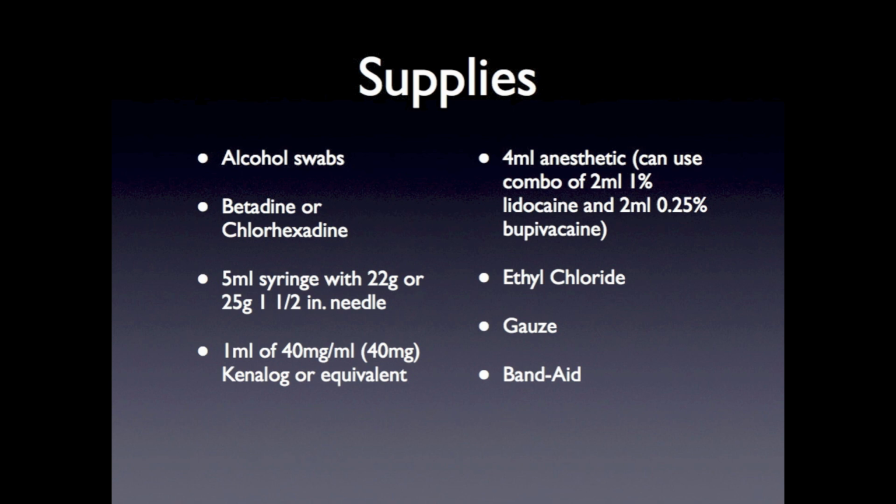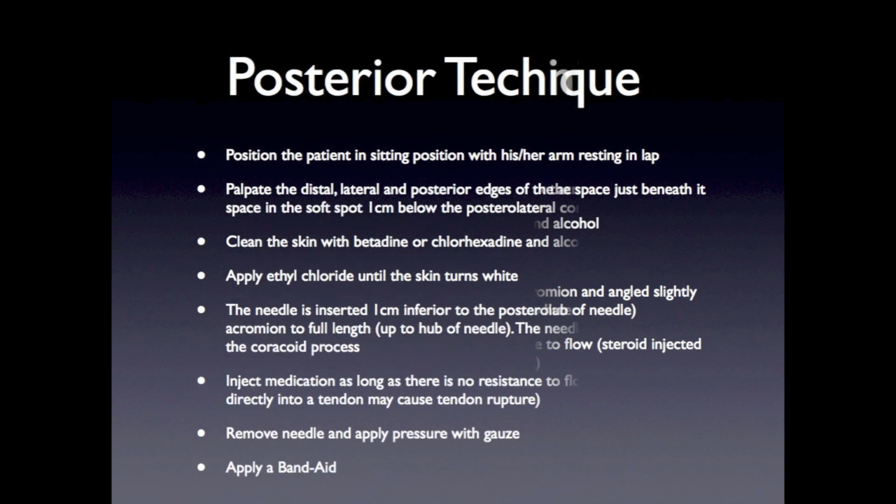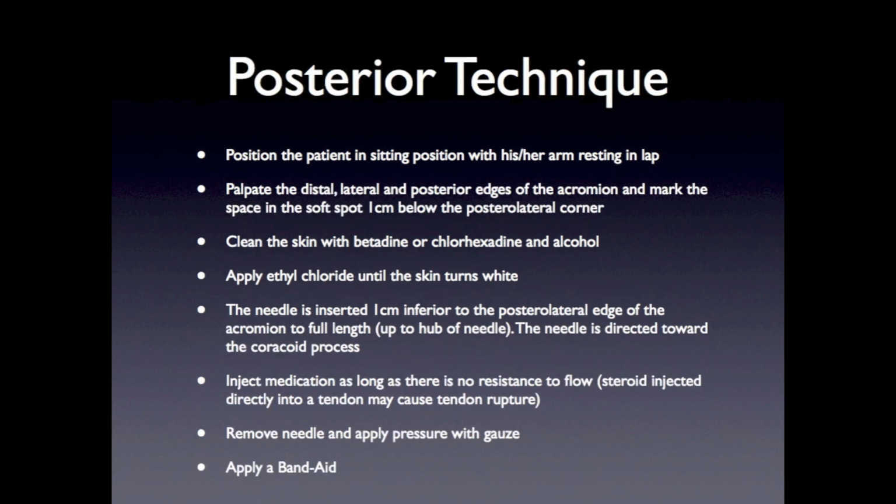This is a summary slide showing the supplies needed for a subacromial bursa injection. This is a summary slide describing the technique for a lateral subacromial bursa injection. And this slide summarizes the posterior technique for injecting the subacromial bursa.